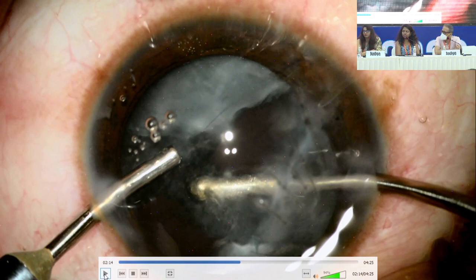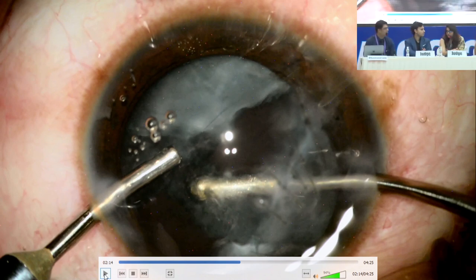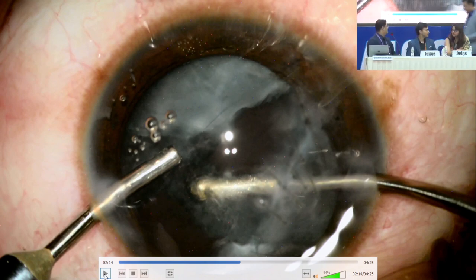You must be using a 23 gauge vitrector? Many times I use 25 gauge. Ah, 25 gauge. So, if you have access to that, then it's very different. I think that's kind of a luxury. If you don't have access, then you really should not probably make a 20 gauge. 20 gauge is a little tough because then you have to suture it and all of those problems. But I would still say it's not a big problem suturing that as well.